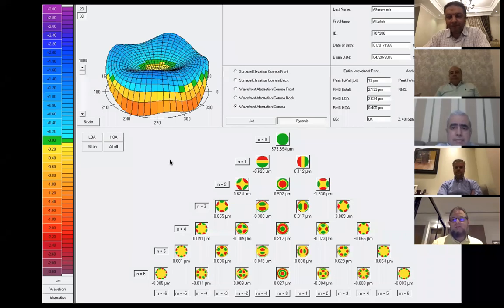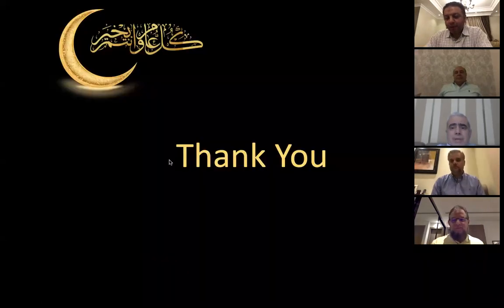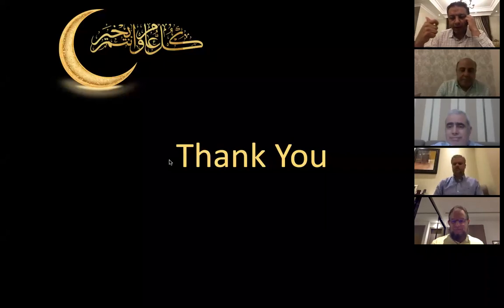Exactly. Yeah. But this is the last case. Do you have any questions? Do you have images for this case after stopping the rubbing, or are you expecting that? Okay. No. Okay, sir, but here two points are very important: the epithelial mapping and the study of the corneal biomechanical properties. Yes, exactly.